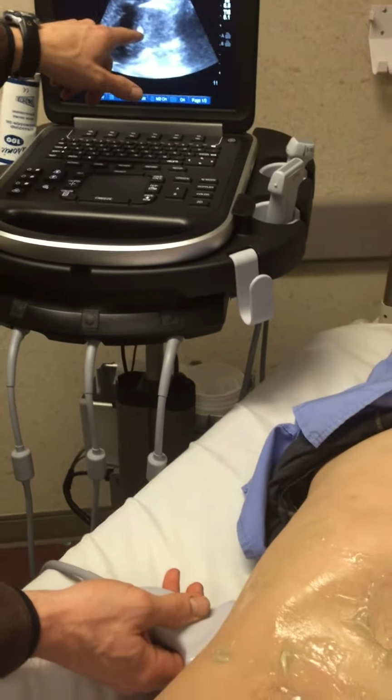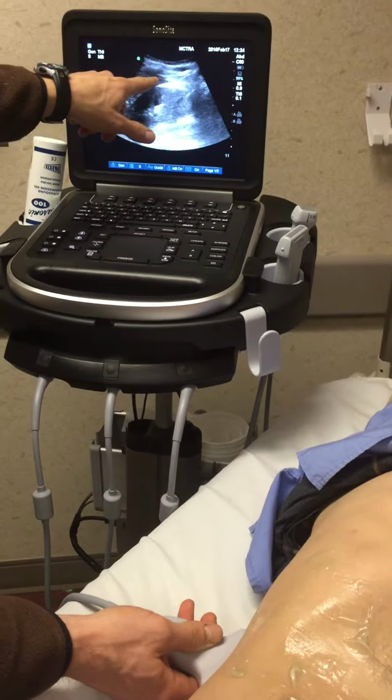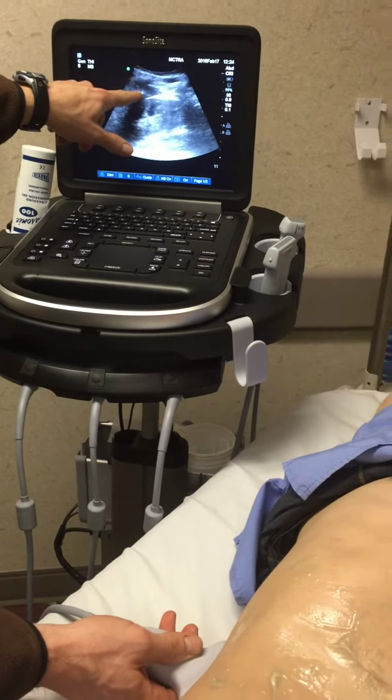You can see on the screen the inferior pole of the kidney, superior pole. You're going to see fluid collect right anterior to this region first, and it could extend into the liver, into the Morison's pouch region here.